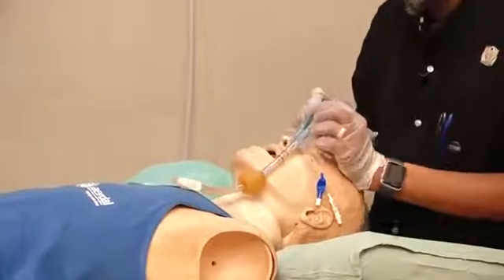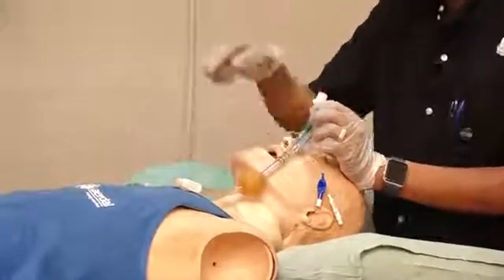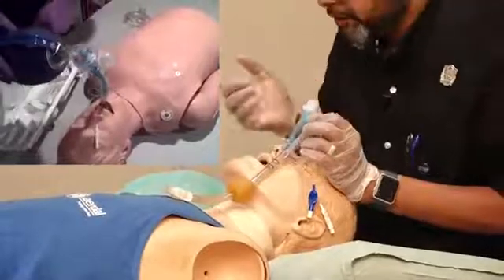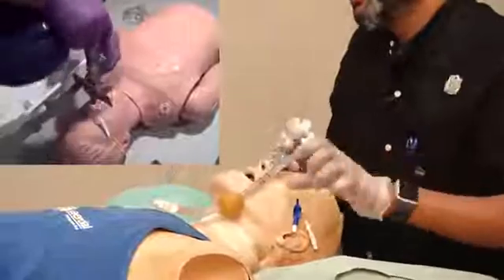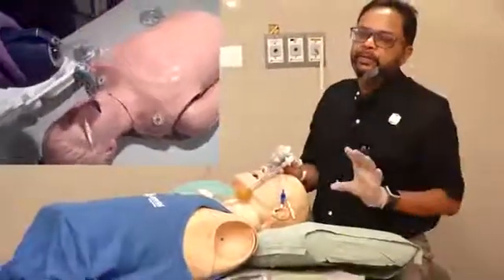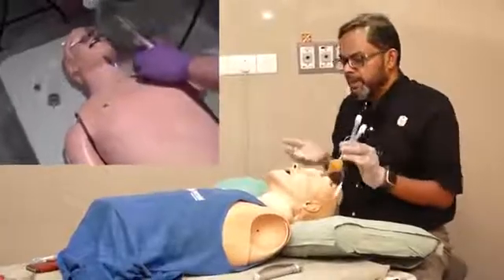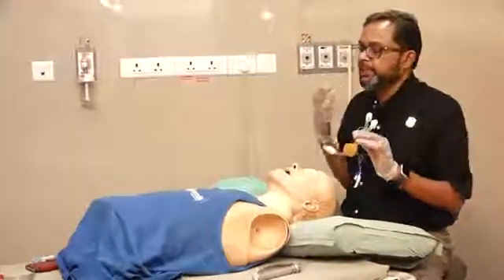If you are not getting a chest rise while ventilating through tube number one, it means the tube is currently in the trachea. In that case, shift ventilation from tube number one to tube number two — you will get air entry. This is the combi tube; it is a very simple device usable even by a paramedic in a pre-hospital or ambulance scenario, or for someone with a difficult airway.